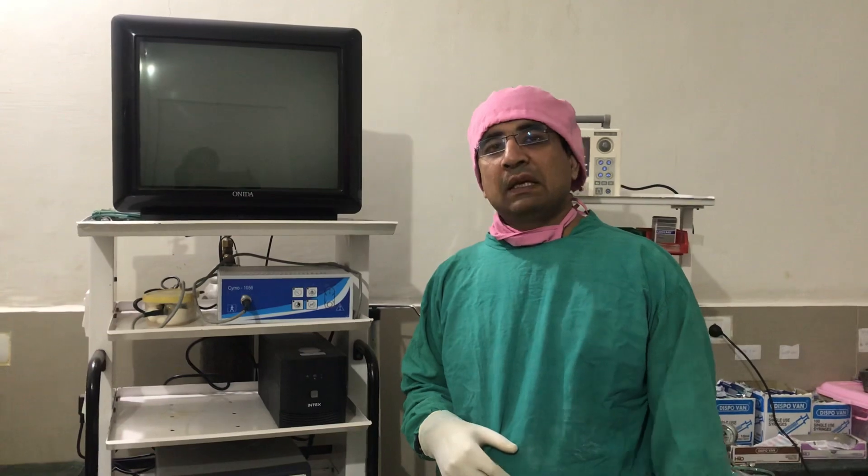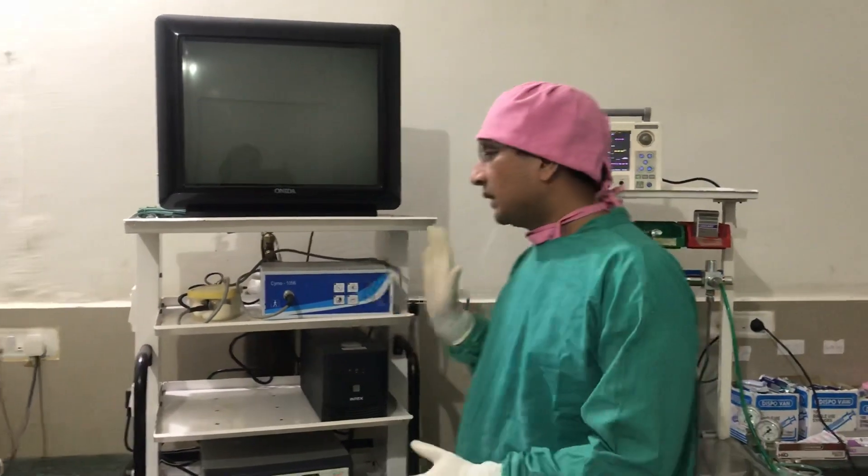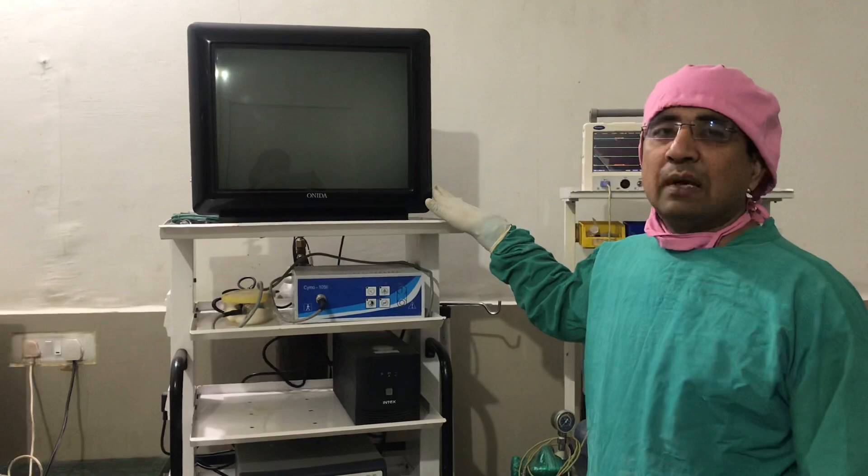Today, there is a laparoscopy and hysteroscopy. I am going to show you a video. First, what is laparoscopy and hysteroscopy?